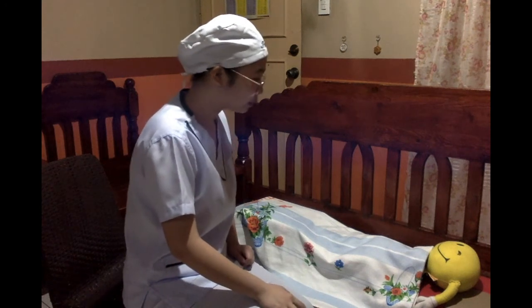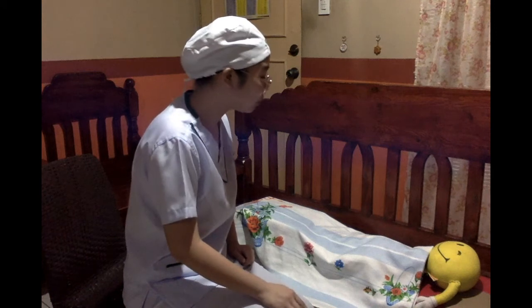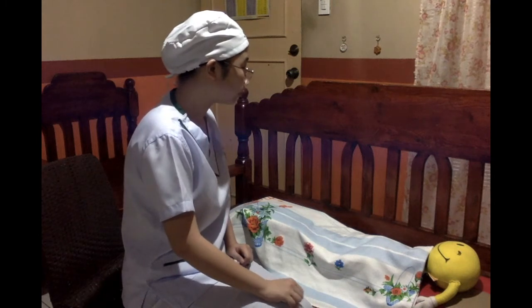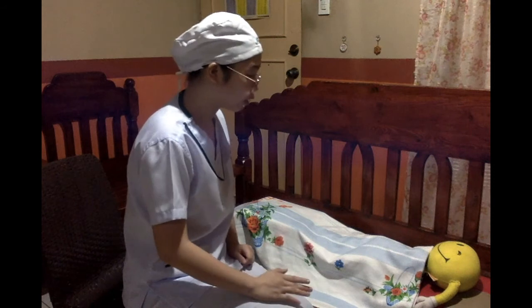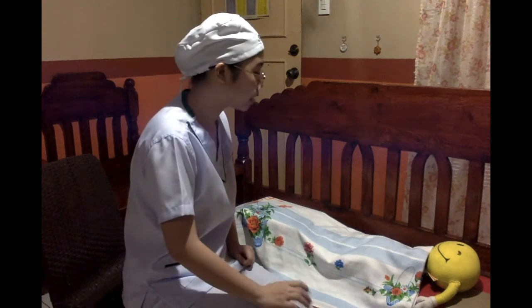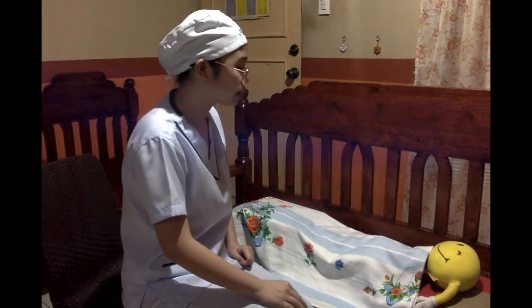Pumapayag po ba kayo na gawin po ito? Okay po, talaga makakatulong po ito sa inyo. At saka po pala, Miss Smiley, habang po ginagawa natin po yung pagsusonda po sa inyo, paalala ko lang po na huwag po masyadong malikot. Opo, kasi hindi po natin pwedeng hayaan na may makapasok po na mikrobyo po sa loob ng inyong katawan. Opo, kasi magkakasakit po kayo nun.